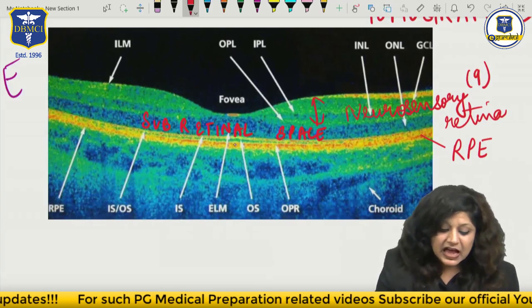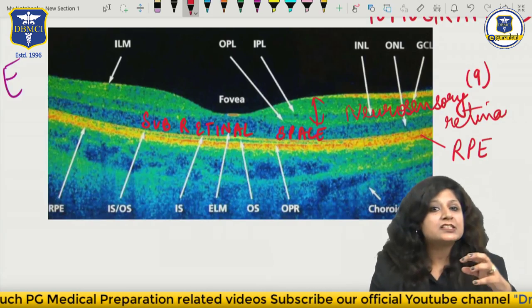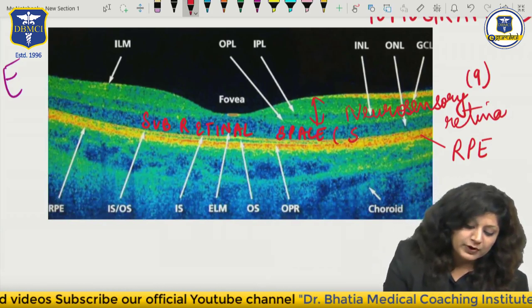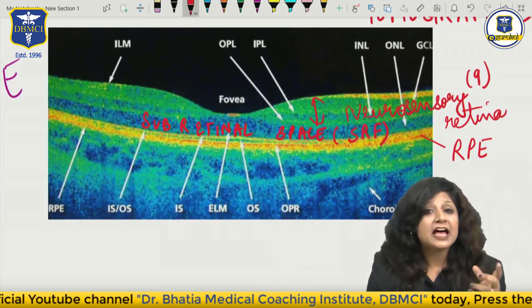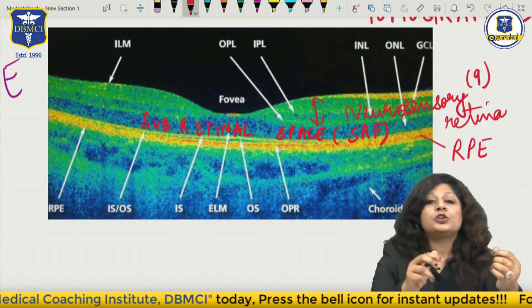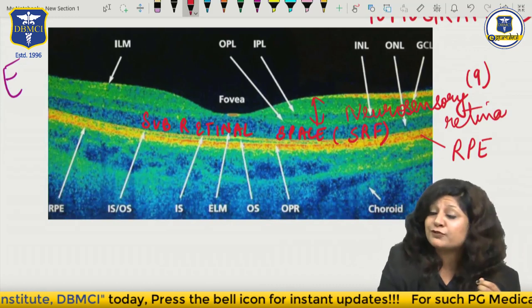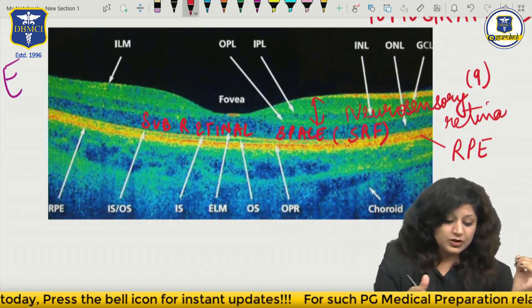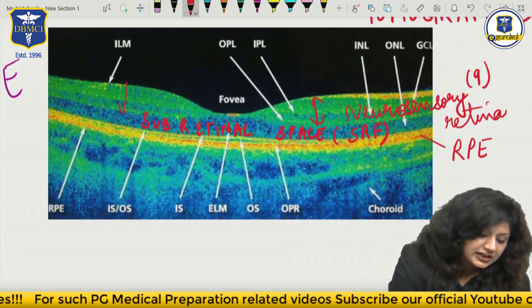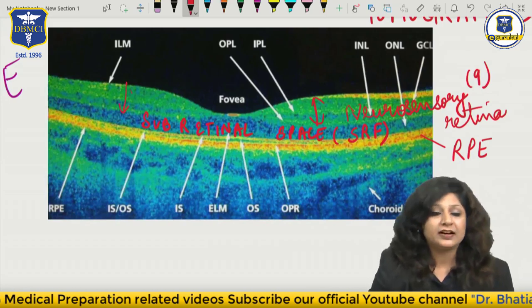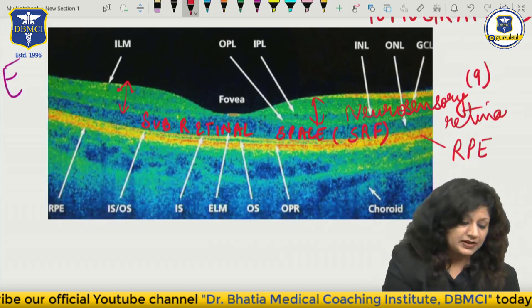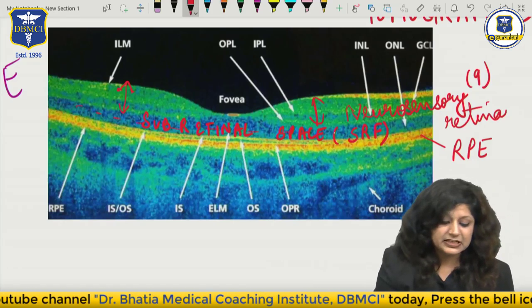Can you see this darker area in colour? Why is this space darker? Because it contains fluid - SRF. What was SRF? The sub-retinal fluid. So you can see the basic structure: this red one is the RPE layer, then this green one is the neurosensory retina, and this darker one is the sub-retinal space containing the sub-retinal fluid.